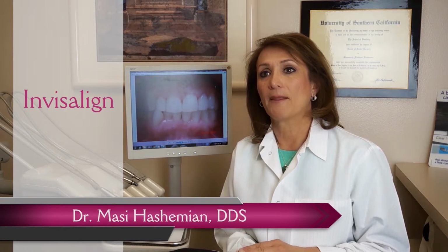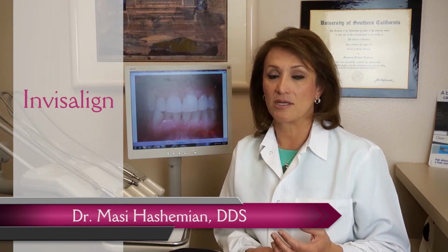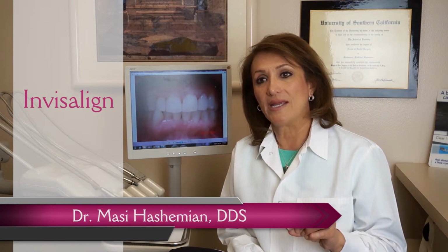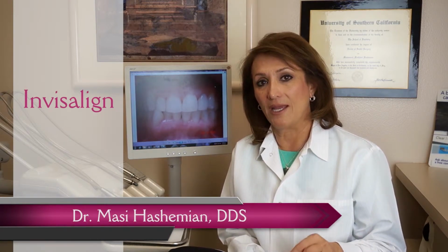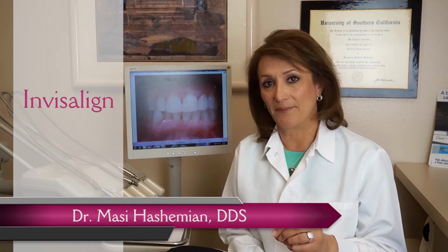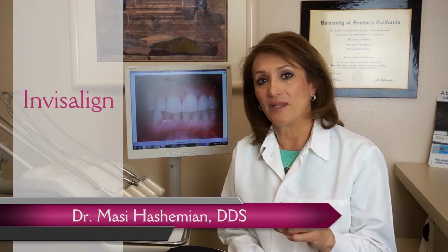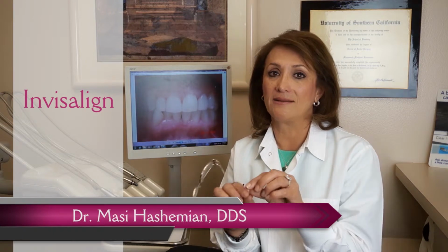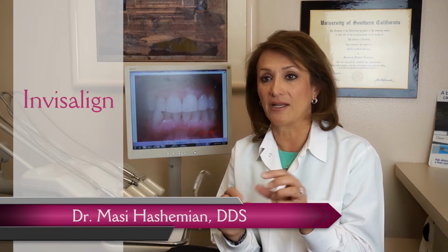That is why when I see a situation like that, I offer Invisalign to our patients. When we align the teeth with Invisalign, basically we use a series of clear trays, and these trays are fitted for that patient, and they're worn for 2 weeks at a time. In 2 weeks' time, the teeth are going to be directed to go in the direction that the aligner is. We call it aligner. The clear trays are called aligners.